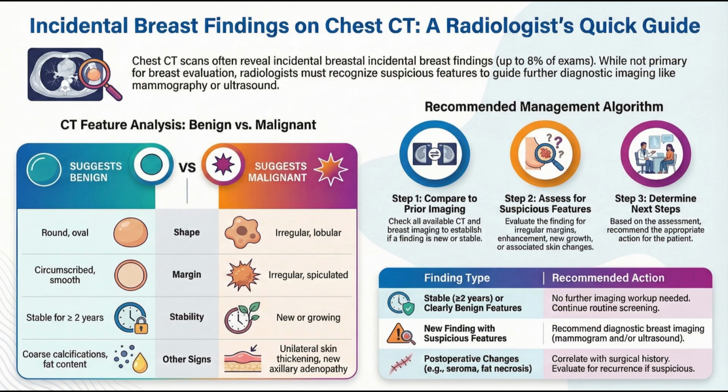And what are the red flags? What screams malignancy? Irregular margins. Yeah. Lobulated. Or worse, spiculated, that classic starburst pattern. Okay. Also, if it has heterogeneous, messy-looking insides. If it's new or growing, and of course if it enhances more than that 33 HU threshold.